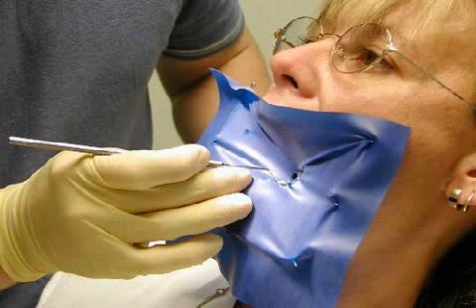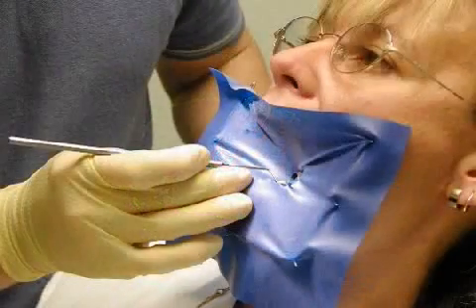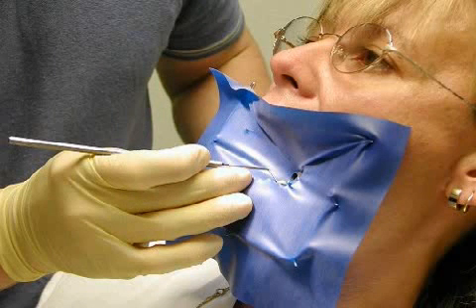A dental dam is a rubber membrane used for completely isolating dental work areas. Many materials used in dentistry are very sensitive to moisture. For example, a dental dam should always be used when gluing ceramic inlays or in the case of plastic fillings, since the quality of the work would otherwise be severely compromised.